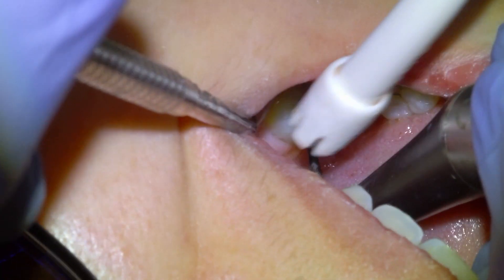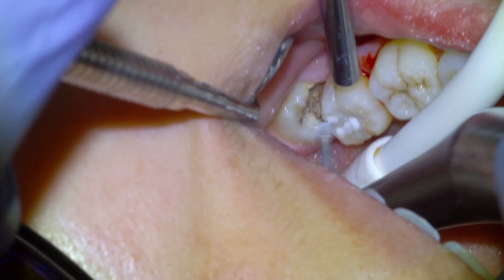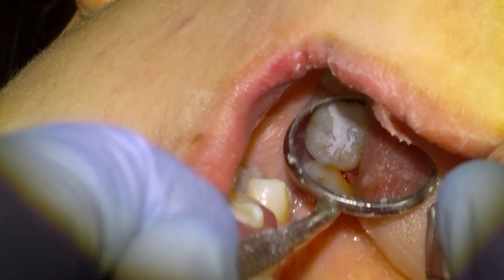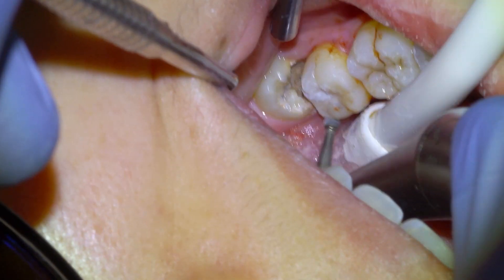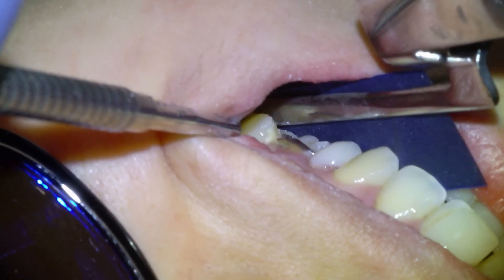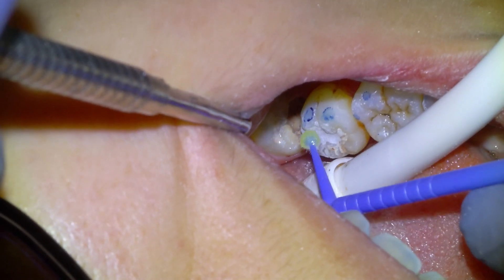We're going to refine the reduction of the excess material with a large carbide burr on slow speed. I always love finishing Equia Forte because it's so easy to see the margins. We're pretty much happy with the restoration, and we're going to check the bite to ensure there's no contact on the filling — have the patient bite down and grind hard. We're satisfied with that.